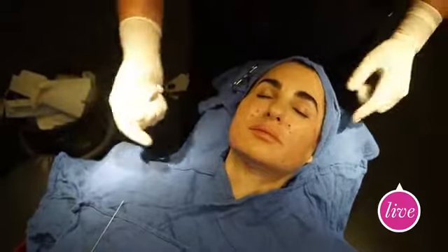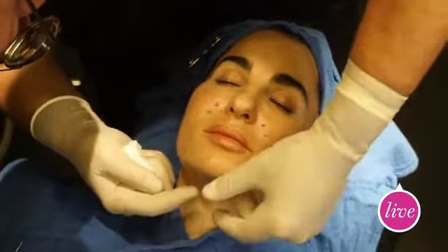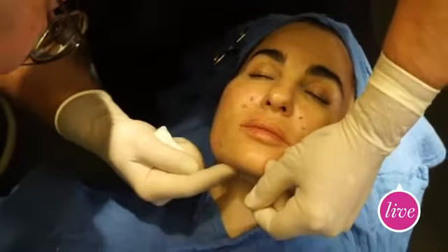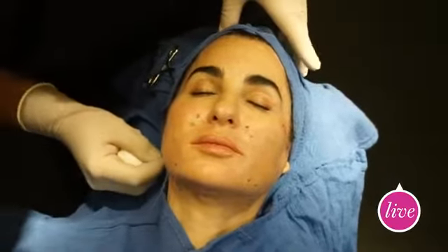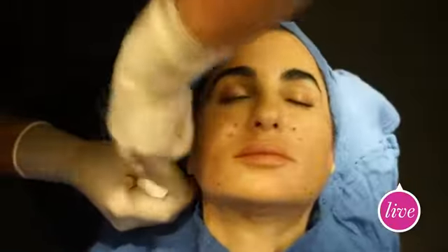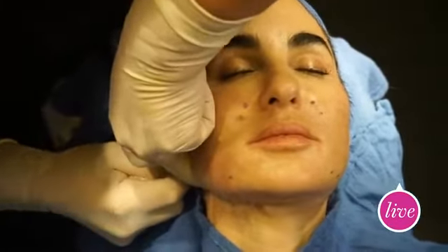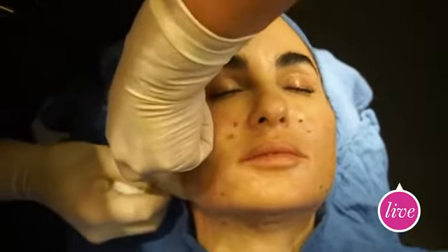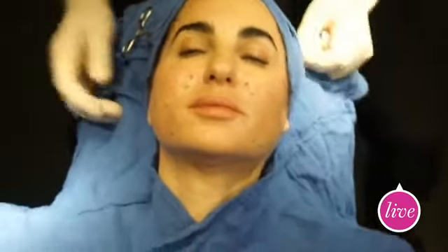The jowl has disappeared, and all of the skin from the midline, you see how it's bunched up towards the side. Now this settles down usually about 2-3 days, and more. That's it. And you can see the effect that I've created right here just by pulling on the suture. Amazing, especially in the neck and the cheek. And the amazing thing is that we have done it through tiny little punctures, without any incisions. It completely changes the look of the face. Okay, so let's keep going for the next suture.